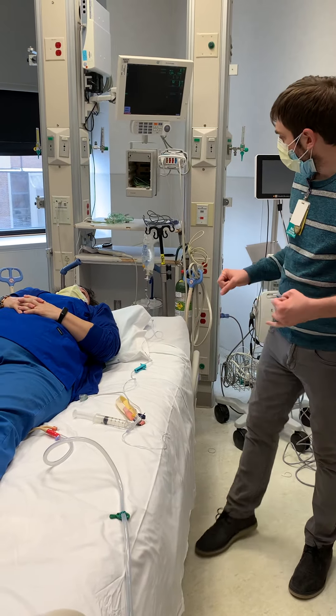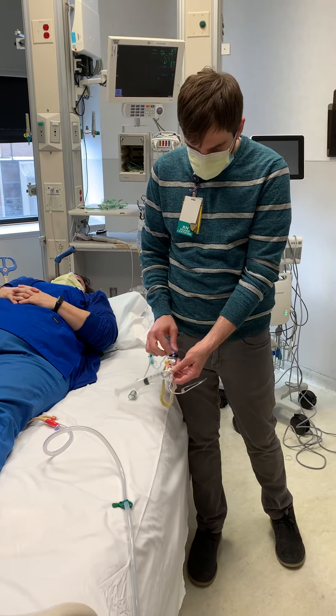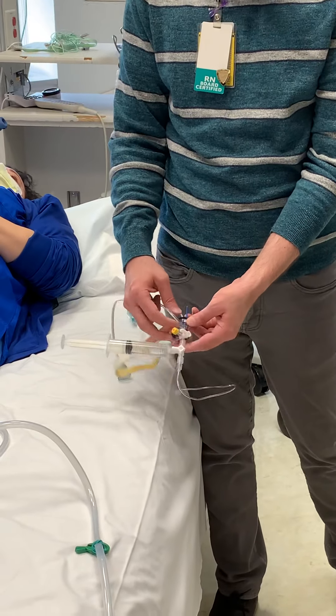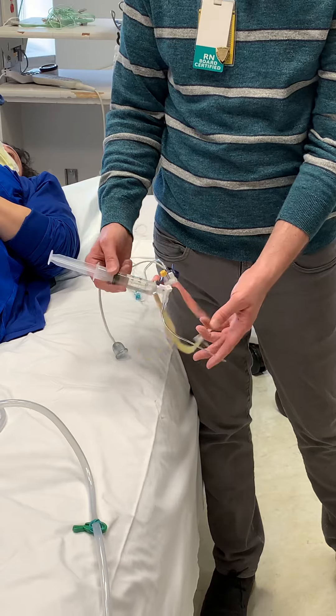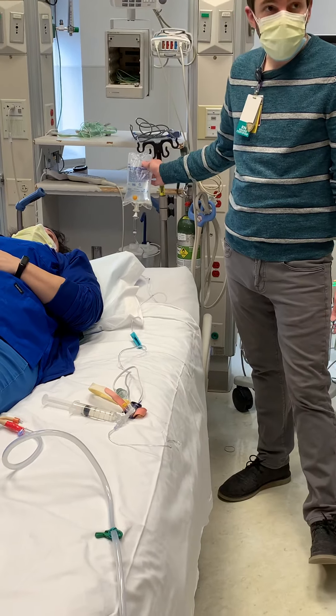Step number two, we get pressure tubing. This one happens to be an older type of pressure tubing that we're not used to seeing, but any kind of pressure tubing with a transducer on it. Spike that into a bag of saline — it does not need to have pressure on it.